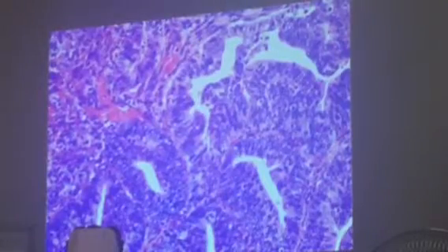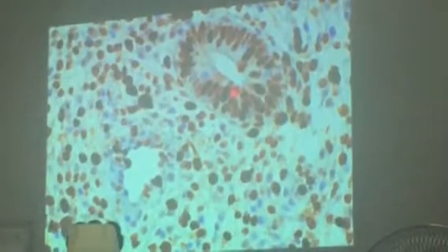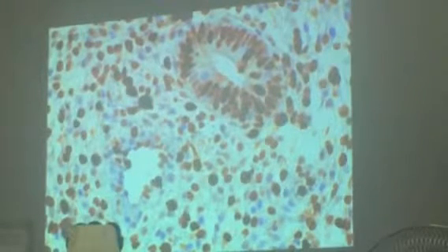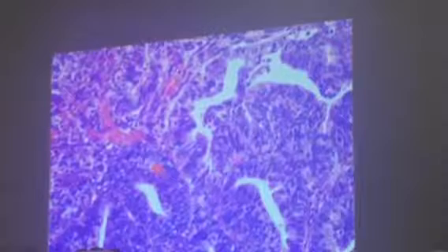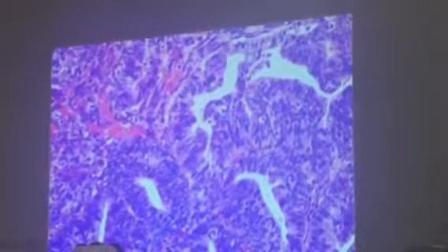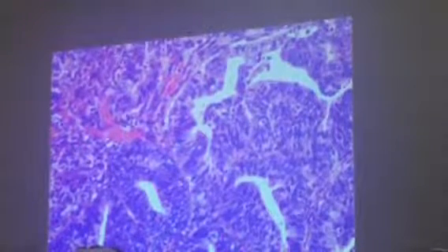So yung proliferative, let's go back to the high power view of a proliferative gland. Okay? The proliferative nucleus is oval. Okay? Kasi it's compressed, di ba? So it's very oval. But the moment they become round and plump like this, atypia na siya. Okay? And you may even see prominent nucleoli or nucleolus.